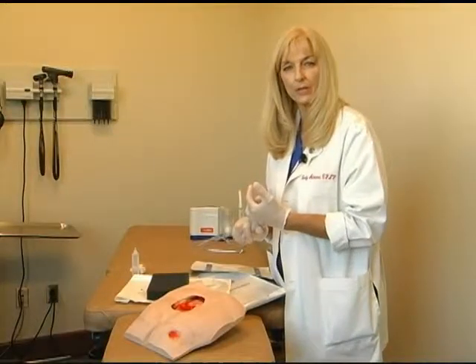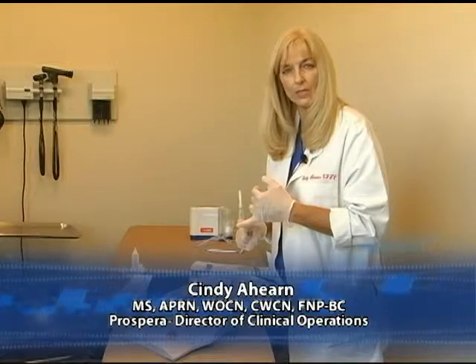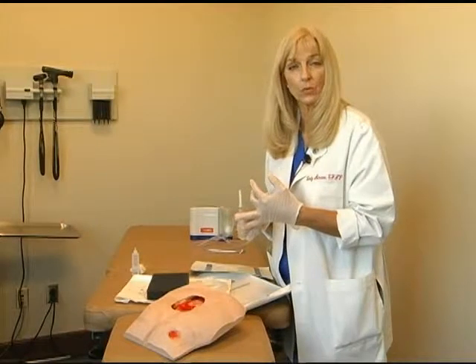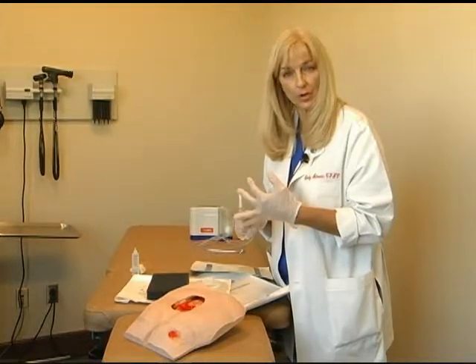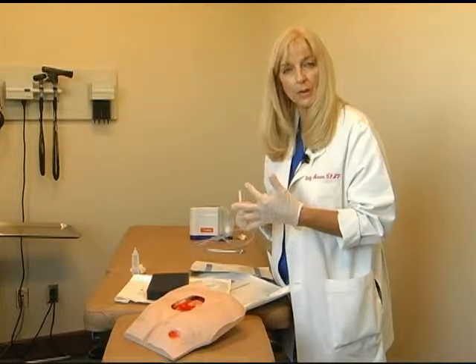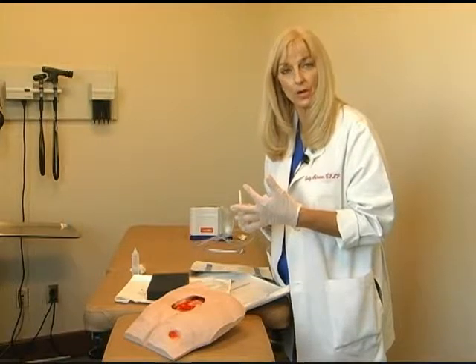There are three basic components of negative pressure. Number one is the pressure — how high or how low it should be set. The second is the wound filler, understanding the pros and cons between the different wound fillers, whether it be black foam, white foam, or AMD cotton gauze. The third component is the mode — how pressure should be delivered, whether it's continuous or variable.